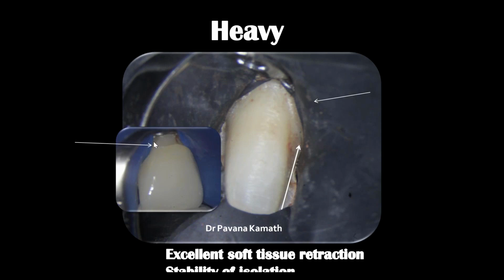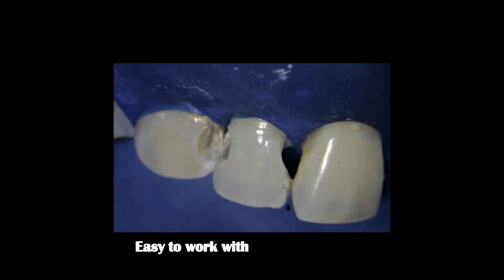Second thing, can you see how much it has invaginated? Now, this is a central incisor. This is an Emax crown, and you can see the amount of invagination you can achieve by using a B4 clamp and using the heavy sheet. You can clearly see the margin, and even the flash can be removed easily. So, heavy sheets give you excellent soft tissue retraction and stability of isolation. What about the medium sheets?